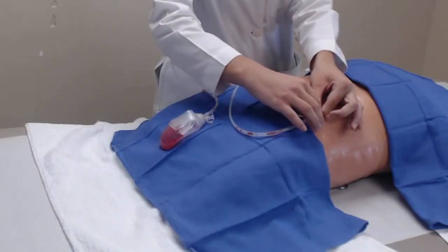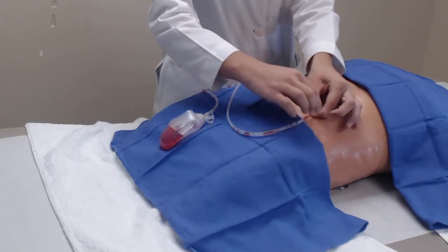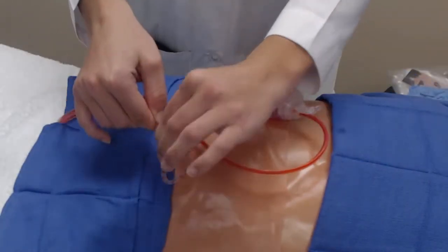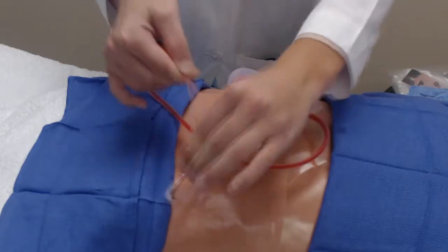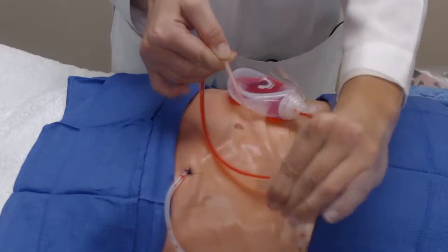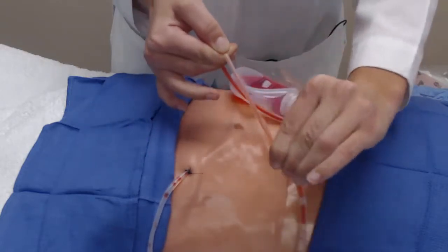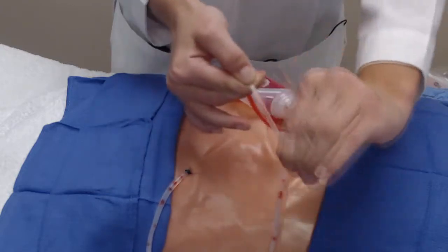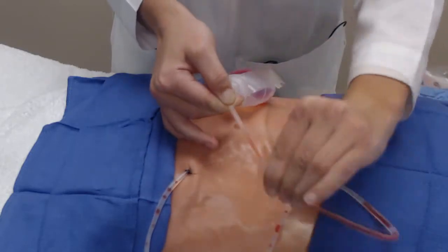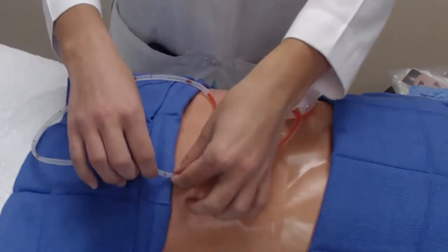You will pinch as close as you can to the black stitch seen here. Then you will pinch below your hand closest to the black stitch and milk down the tubing. If you would like to step your fingers down the tube drain, you make sure to have your hand furthest away from the body pinched at all times so that you do not lose suction. And then you would continue to work your way down the tubing, keeping one hand pinched on the tubing at all times. And you continue this process all the way down the tubing to the drain bulb.